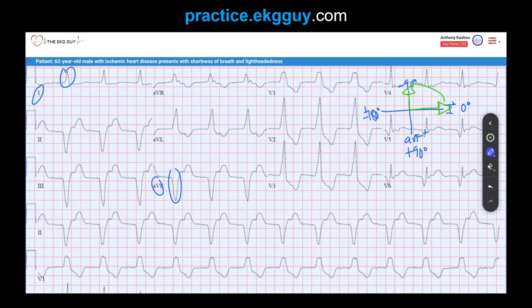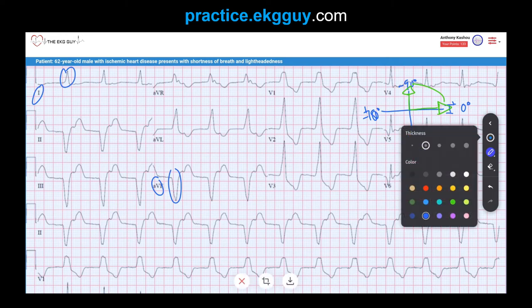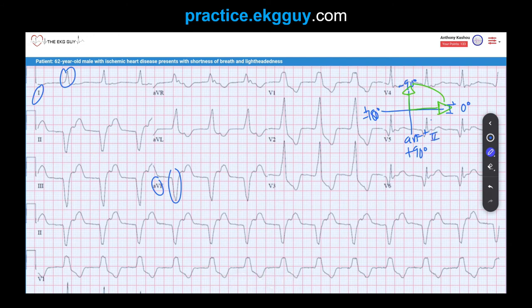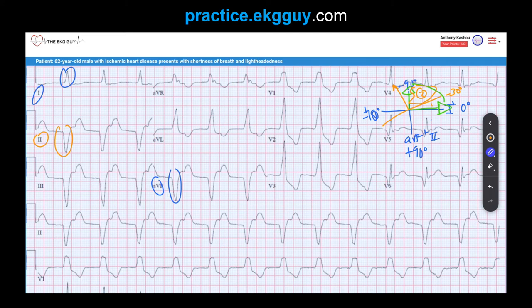To determine whether this is a true left axis deviation beyond negative 30 degrees, we look at lead II, which sits at positive 60 degrees. Conveniently, the perpendicular to lead II runs at negative 30 degrees — so if lead II is negative, we fall in a true pathologic left axis deviation. Lead II here is negative, putting us in that zone. The axis in this ECG was actually negative 69 degrees — a true left axis deviation.